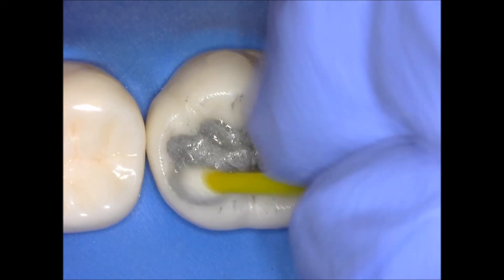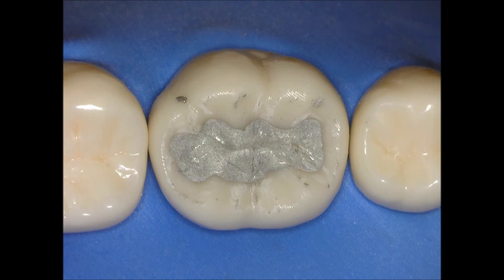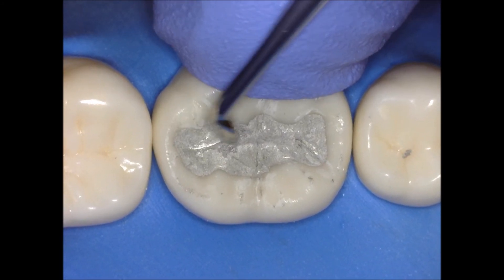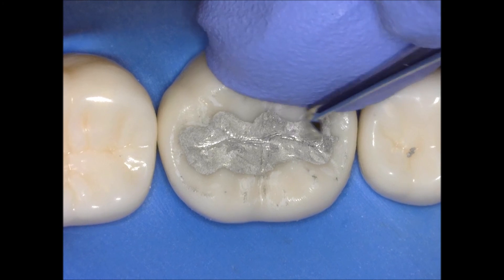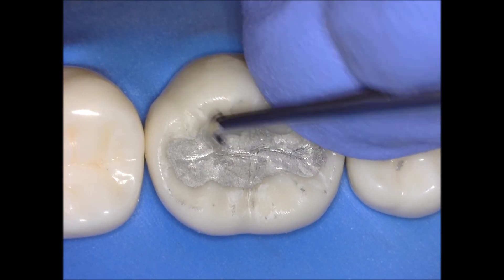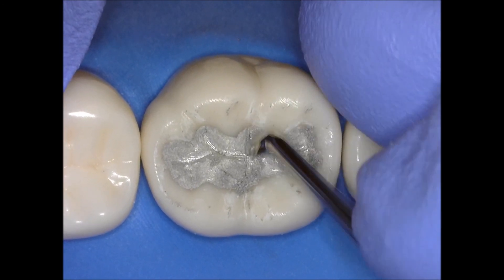I'm cleaning up a little bit more and drying this. Most of the anatomy is already there. If you want, you can go and carve a little bit more just to define the anatomy — this is the moment, because you can see how the amalgam is set now. At this point you can only define the anatomy; you cannot carve much unless you're missing something. But other than that, the anatomy is pretty much done.